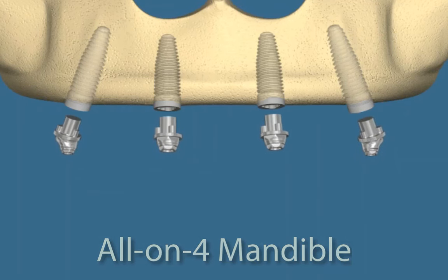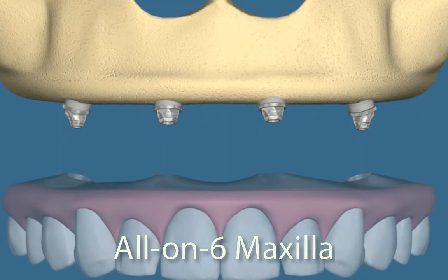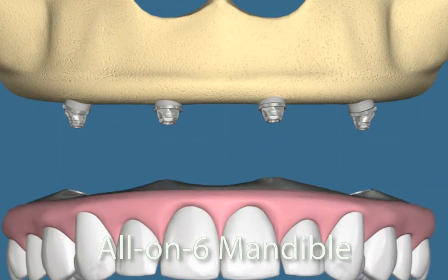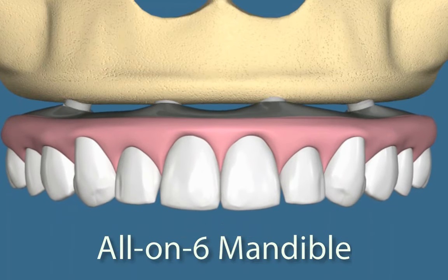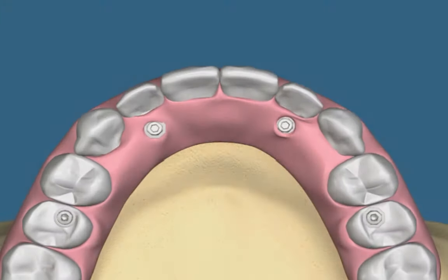After the implants are placed, abutments are added to the implant fixtures, to which the final prosthesis will attach. This prosthesis is held in place by tiny screws that go through the prosthesis and into the implants.